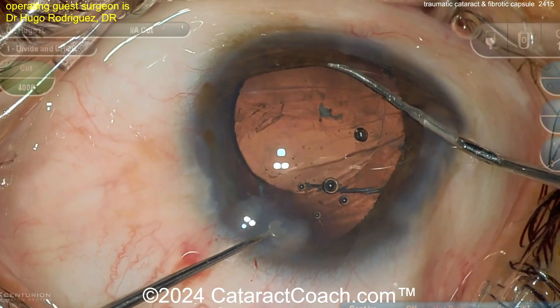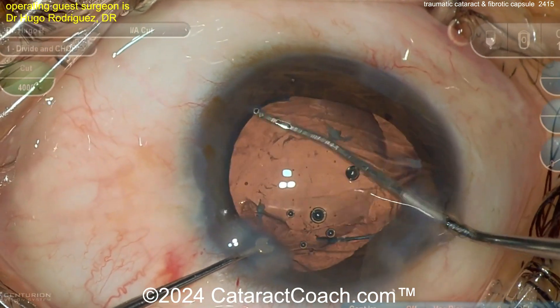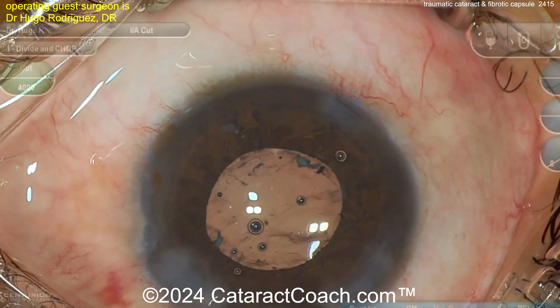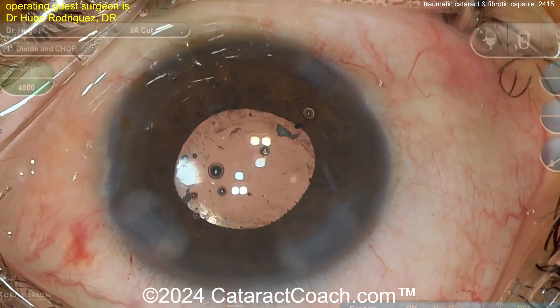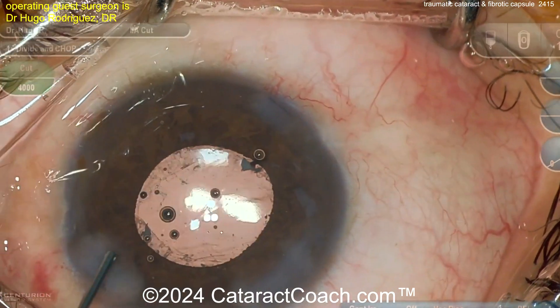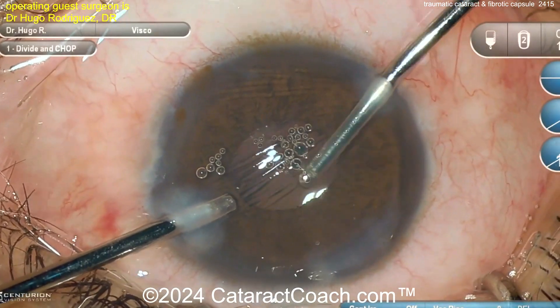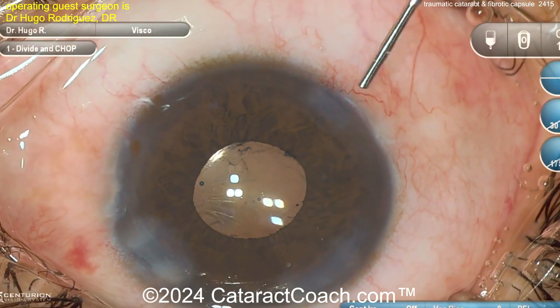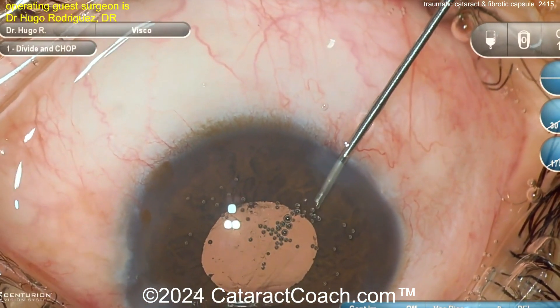Get those haptics in the sulcus, nicely placed. Is there enough of an opening — can you do some optic capture? If you can, that's better. The reason we like optic capture is because it puts the optic in a better position for your IOL calculations, but more importantly it helps hold the optic back away from the posterior surface of the iris, so you're less likely to get the IOL edge rubbing against the posterior iris surface.